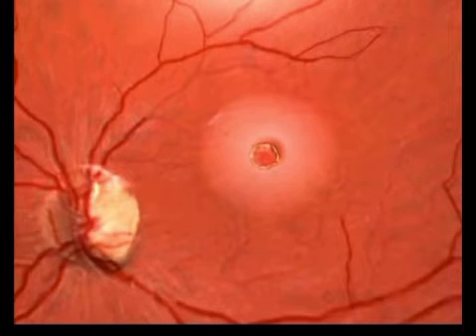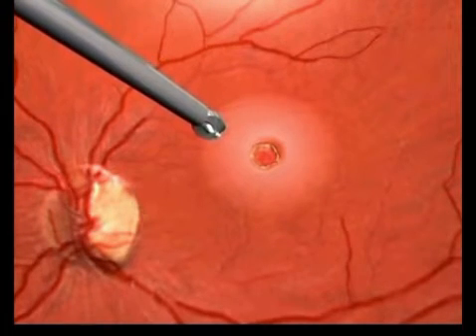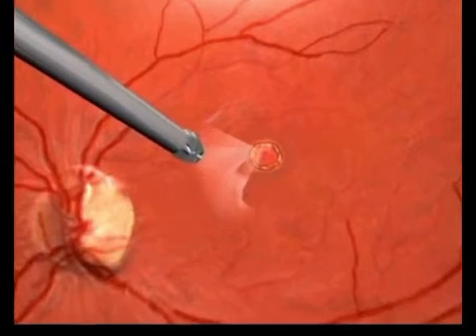To aid in the healing of the hole, the doctor will then remove the internal limiting membrane of the retina in the entire posterior region. This is a film a few microns thick — that is, ten times thinner than a strand of hair.